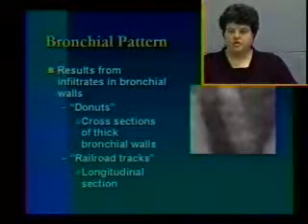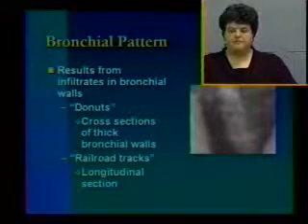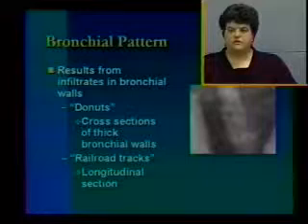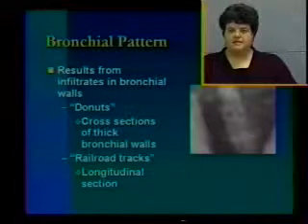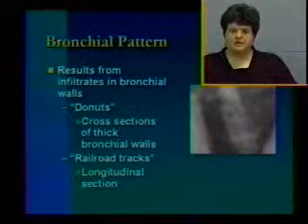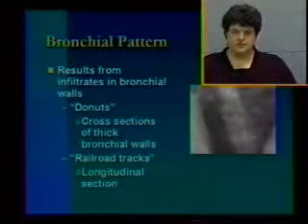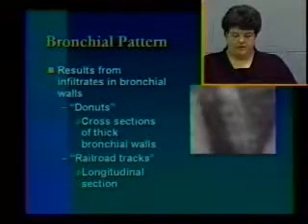Again, this is a pattern with multiple causes, depending on the severity, and things that commonly cause it include allergic or parasitic disease. You can also have an infectious bronchitis, but you really need more information to help you get to the answer as to what might be the underlying etiology.